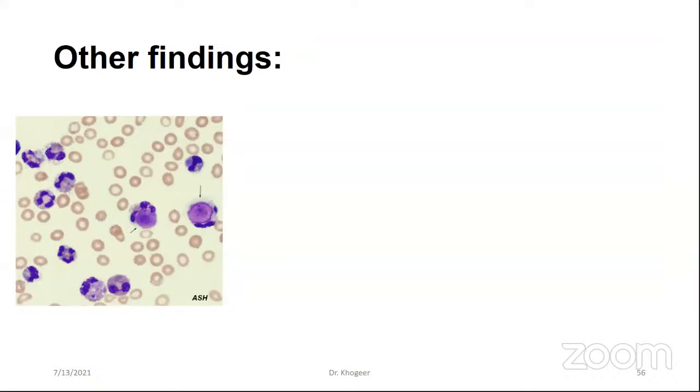Anticoagulated blood is agitated inside the tube by an unknown mechanism, so that nuclei are released from the disrupted leukocytes, and the other neutrophil will ingest this body, which we call the LE body. Again, this LE cell is characteristic of SLE.